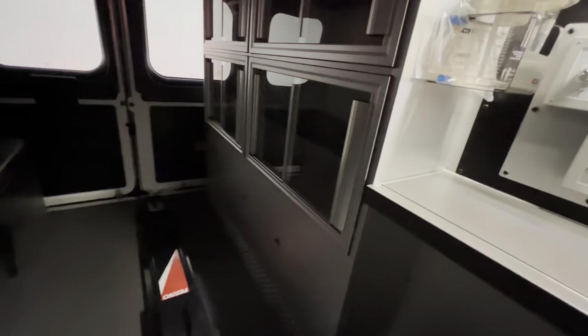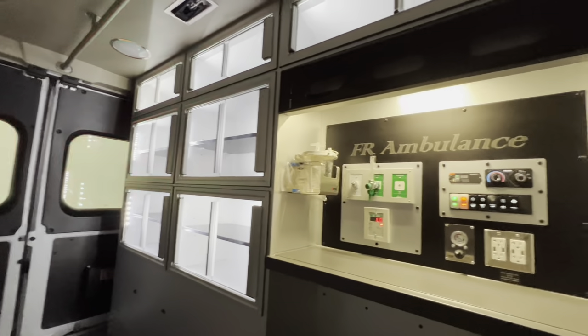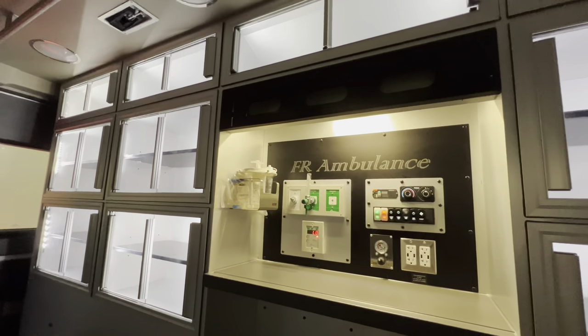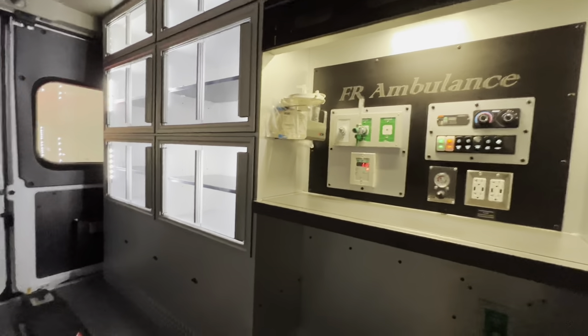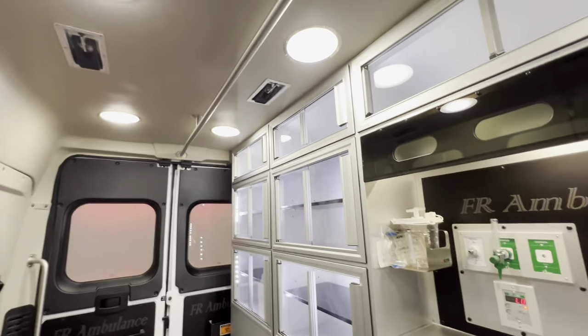If you turn off the night lights, it's going to be dark. A lot of providers also say that they love using the cabinet lights as their night light when they're doing their charts instead of the red lights. So they turn on the cabinet lights and they can still see inside the back of the ambulance with just those on.